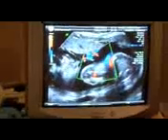Sometimes color is used, and that helps you identify where the cord is located. Sometimes we use it to map the vessels inside the fetal abdomen and body as well, like when we're trying to look at the aorta or the arteries to the baby's kidneys. That is an adjunctive modality that can be helpful as well.